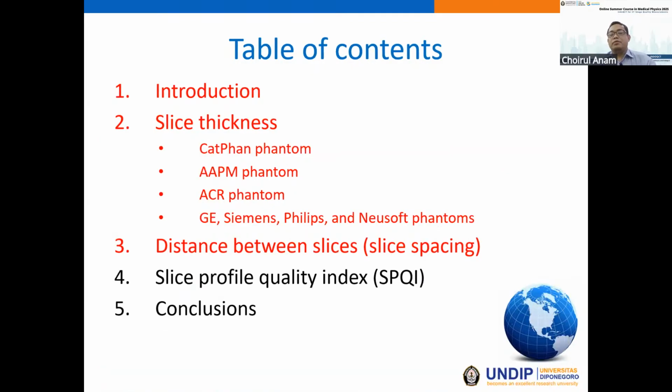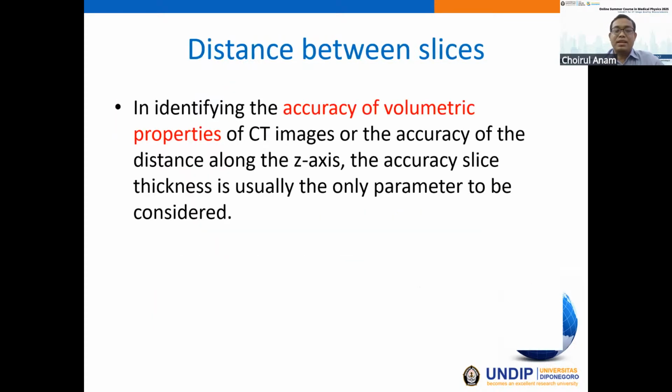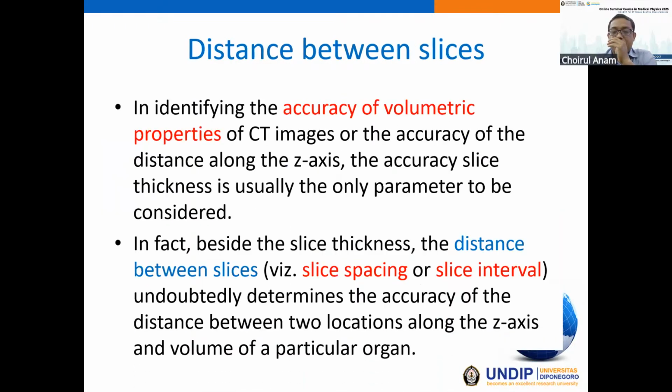Okay, and now we move to parameter number 2. It is distance between slices, or slice spacing. Distance between slices, or slice spacing, is in fact very important. It is as important as slice thickness, in fact.